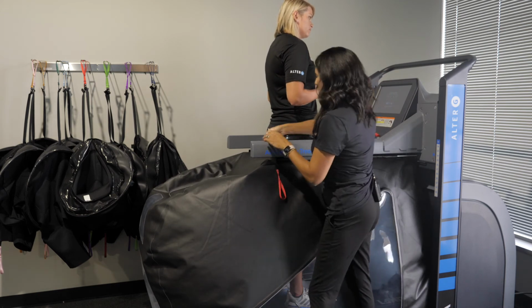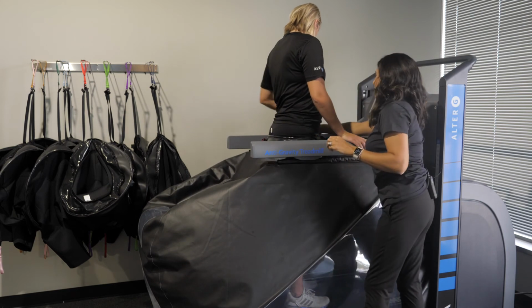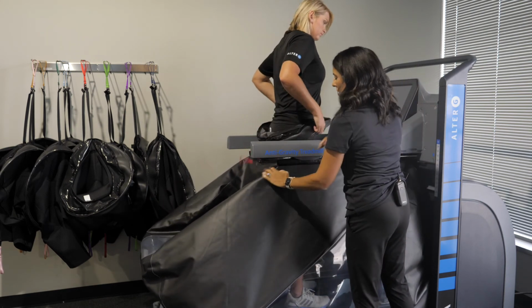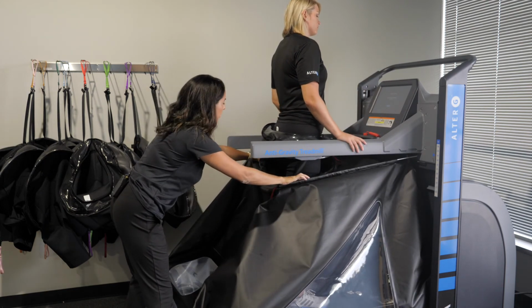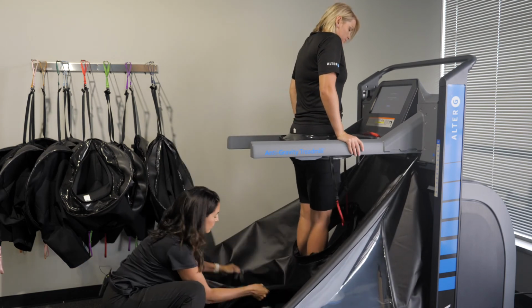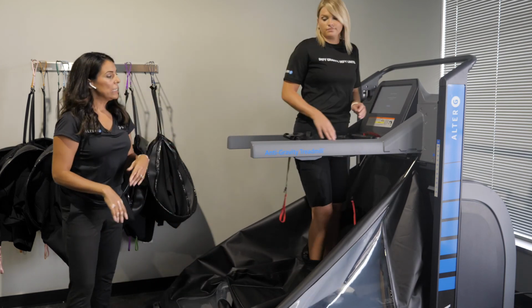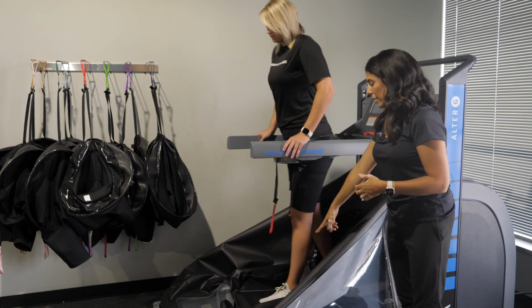But all we're going to do now is just unzip all the way around. And then we can lower the 2 sides of the bag, again, just kind of by, there are handles here. But just pulling down. Have your patient turn around. Again, use the handrails for support as needed and step right off the bag.